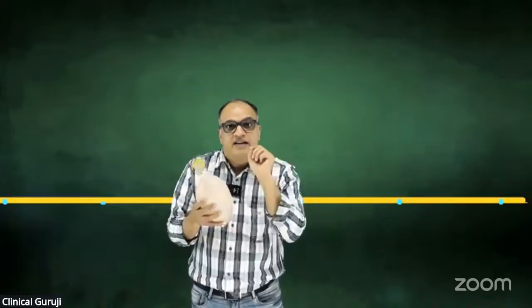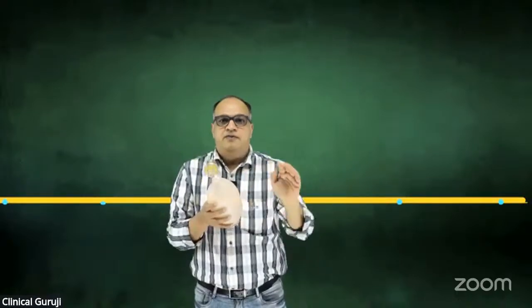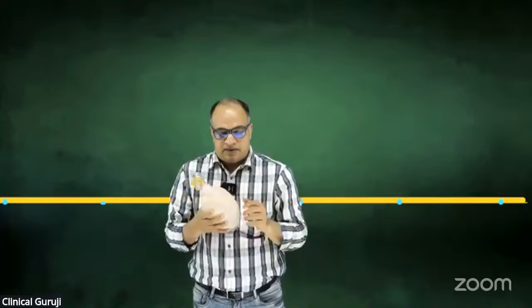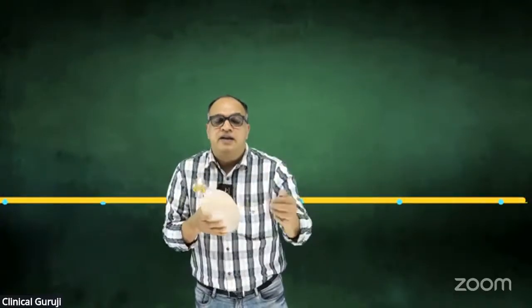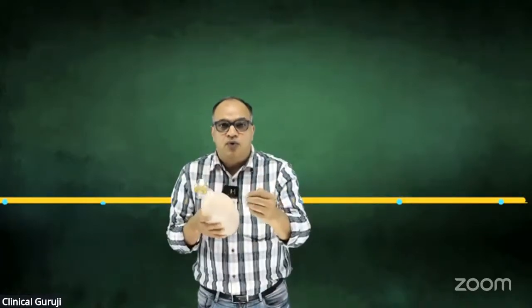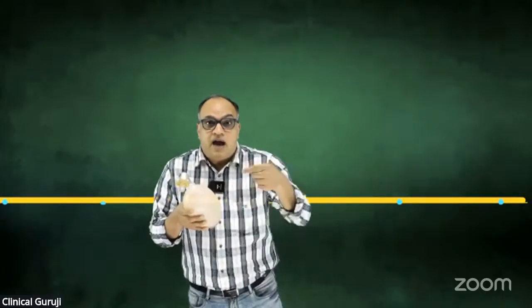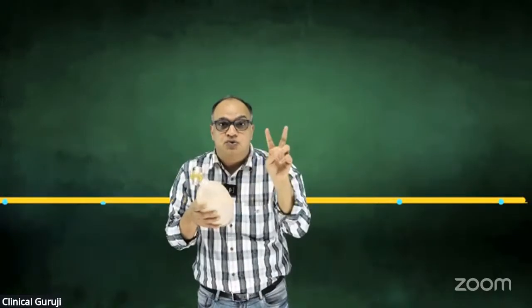What is SIMV? Synchronized. Again, the first breath, 500 fixed tidal volume, given. 1, 2, 3, 4, 5. No effort. 500 mandatory breath. 1, 2, spontaneous breath, 15 pressure support. 1, 2, 3, 4, 4.5, and the patient triggered a breath. At 4.5, the patient is triggering a breath. Now the ventilator has to choose.